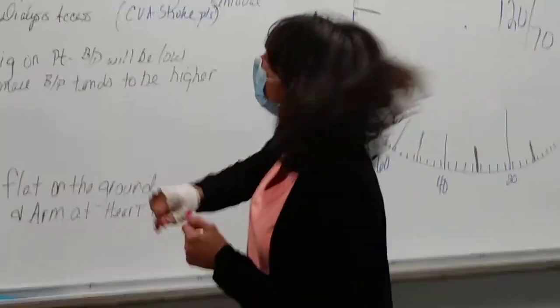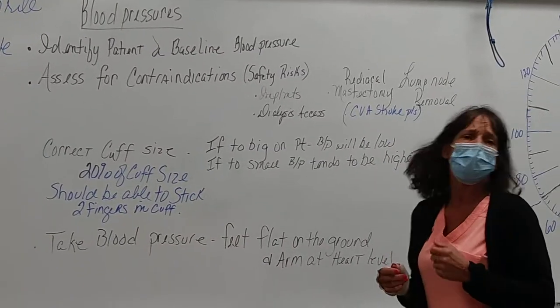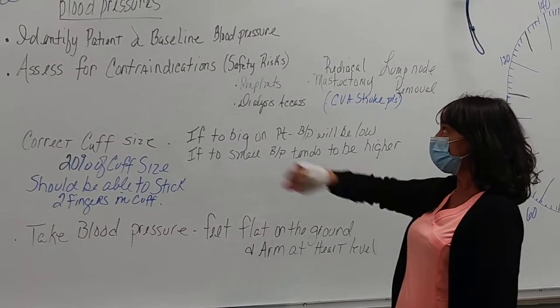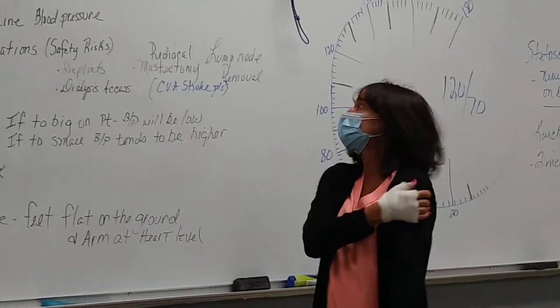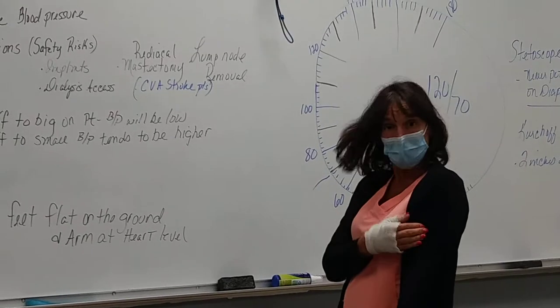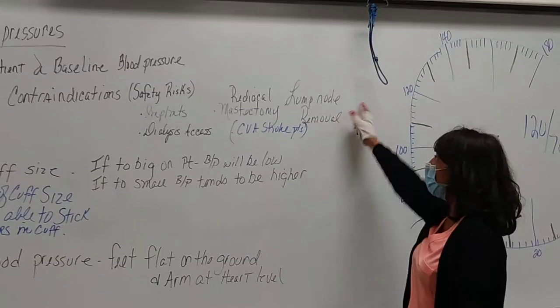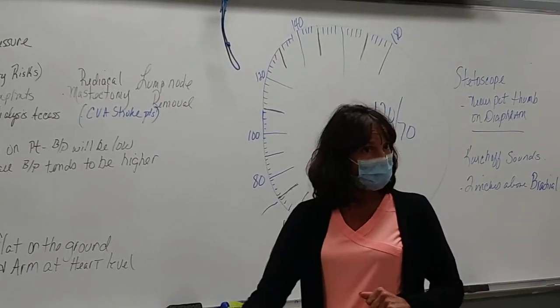And just so you know, you're going to assess for any kind of contraindications on your patient taking a blood pressure on them. Do not do their arm, and these are actually called safety risks as well. If they have implants, dialysis access on that arm, mastectomy, even the CVA stroke patients, you absolutely don't want to do it on that side of the arm. Lymph node removal. So just some things to think about where you want to go to the opposite arm, okay?